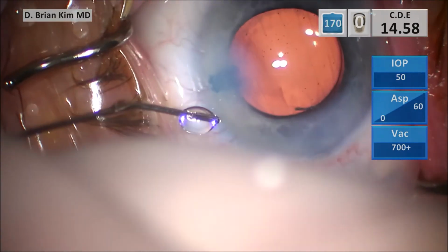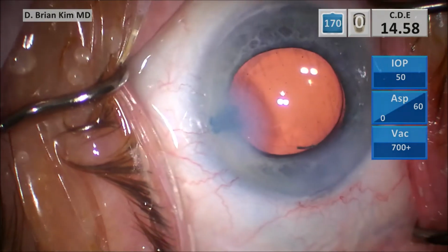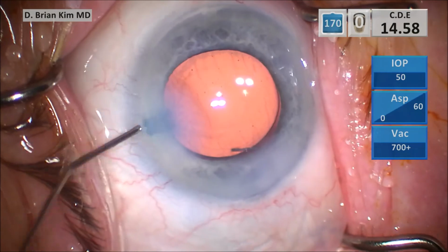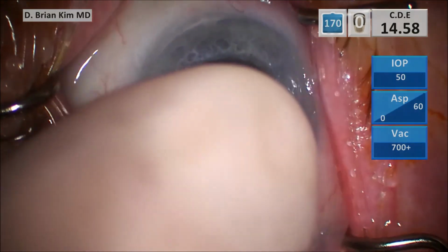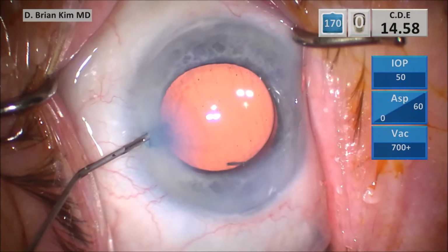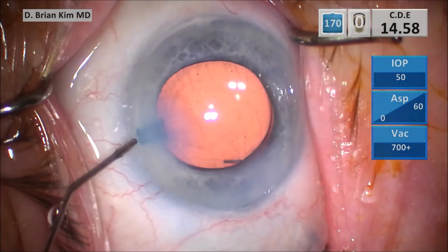But again, you have to have confidence to place that phaco tip deep, and then you're able to get a complete fracture. And then you're able to just crush the lens into smaller and smaller pieces, and emulsify the lens pieces. This patient had a very clear cornea post-op day 1. The patient was very happy. You can imagine going from blindness to great vision immediately after surgery.